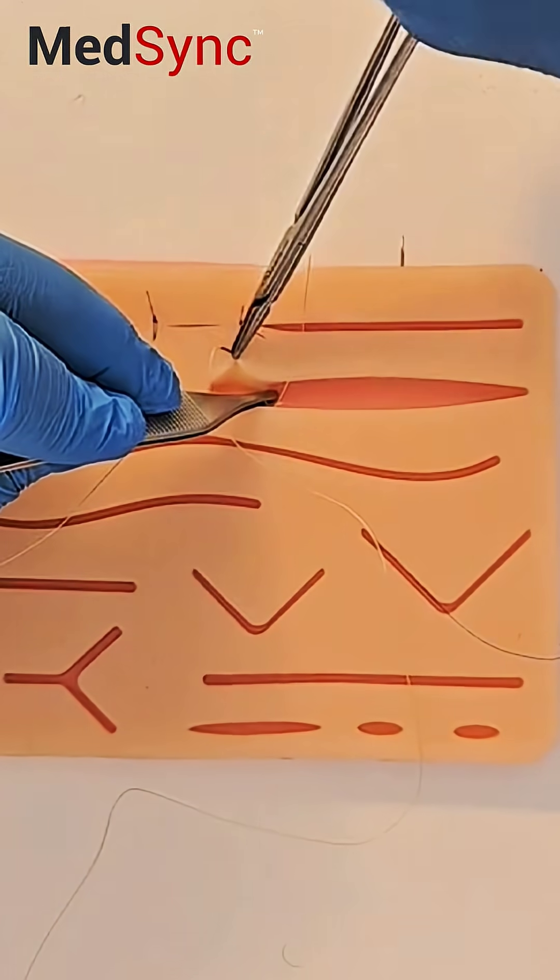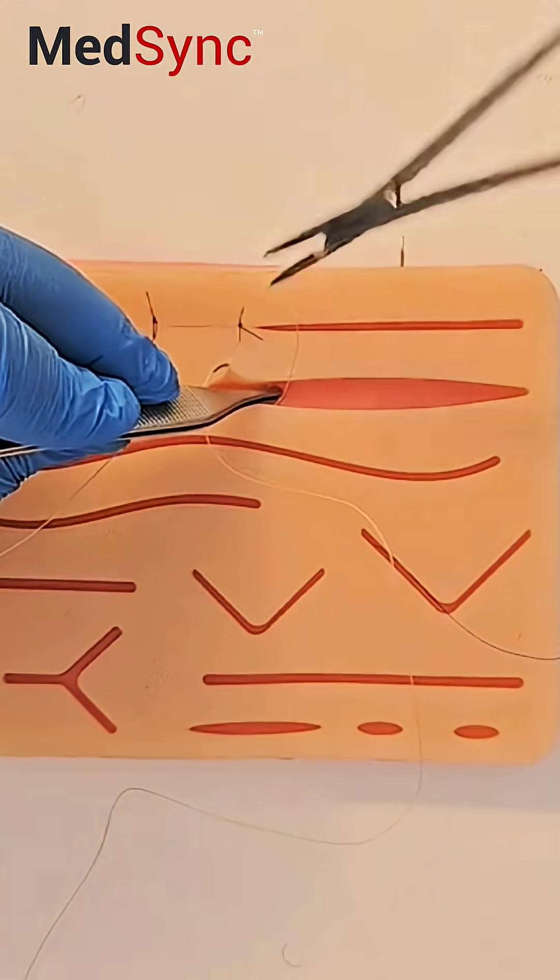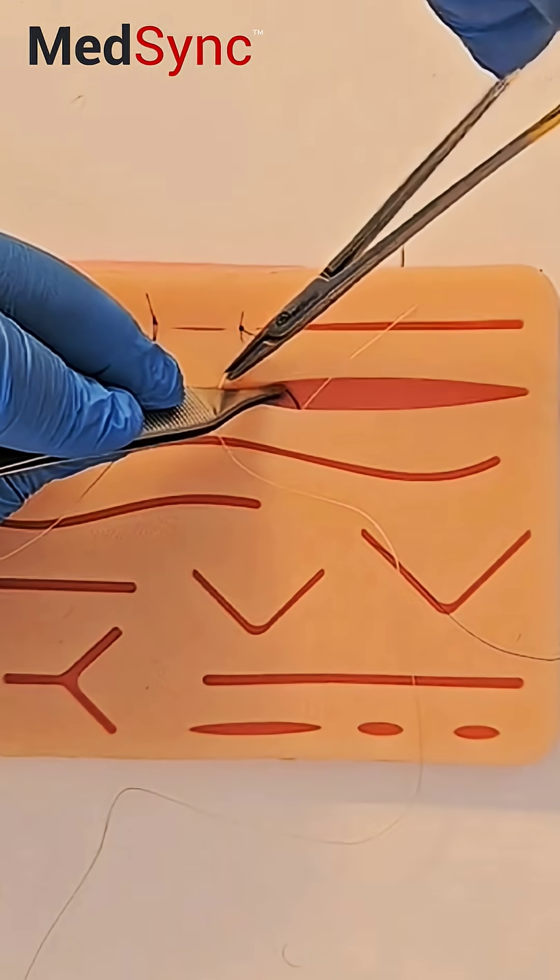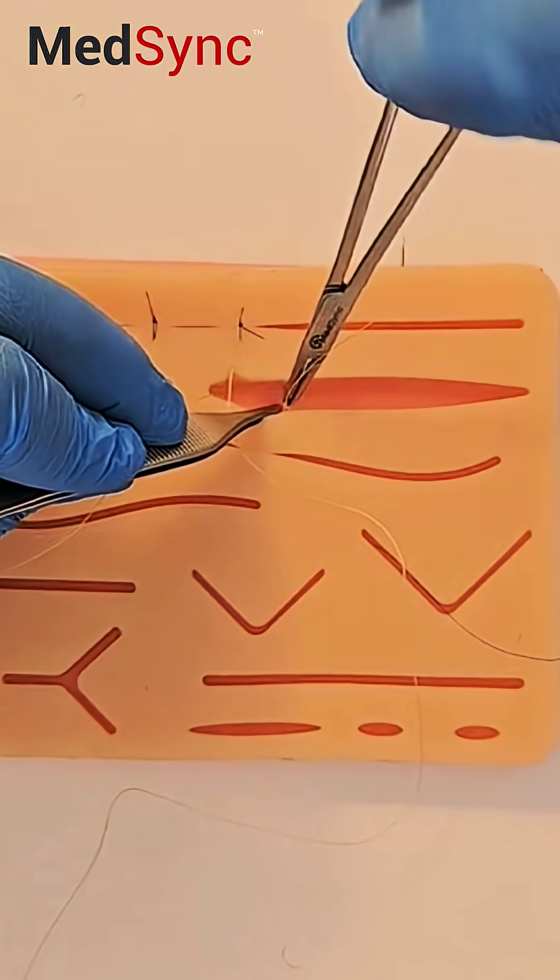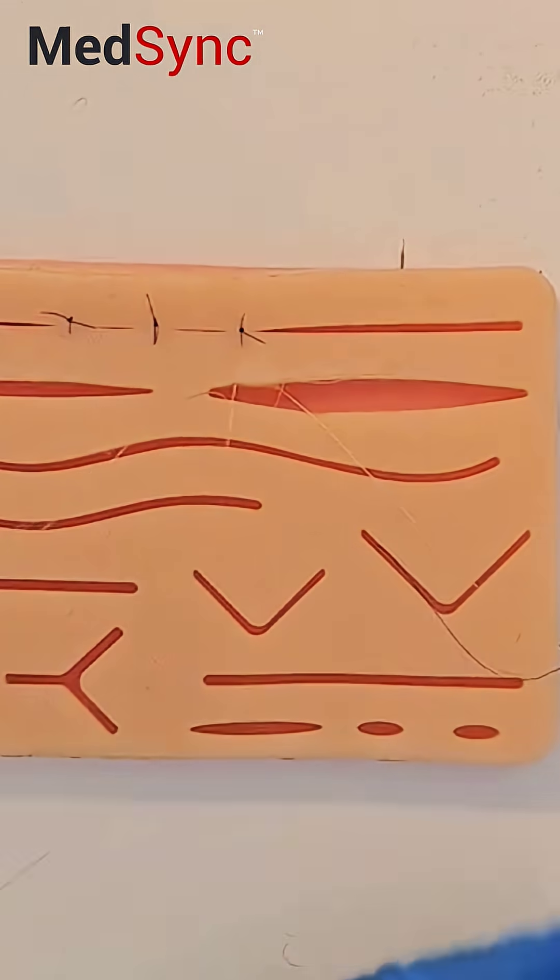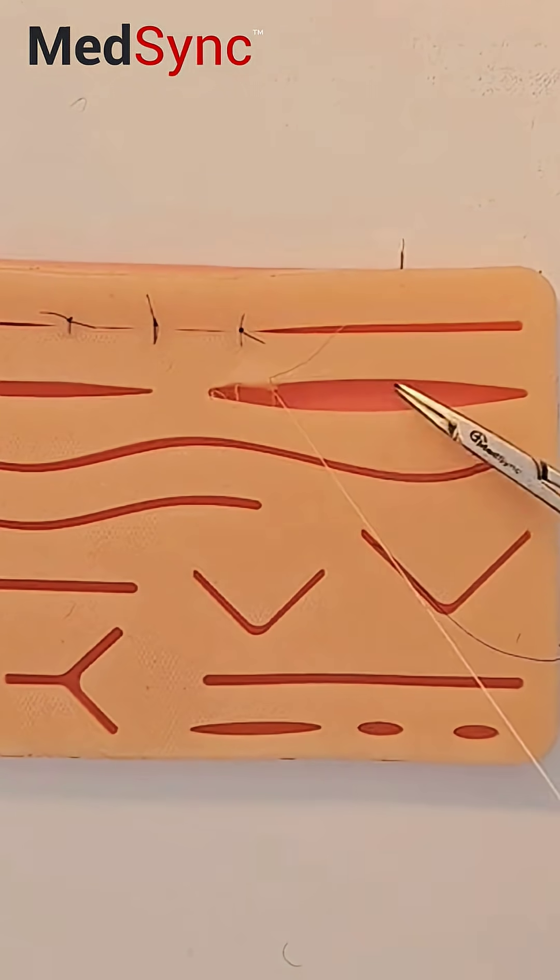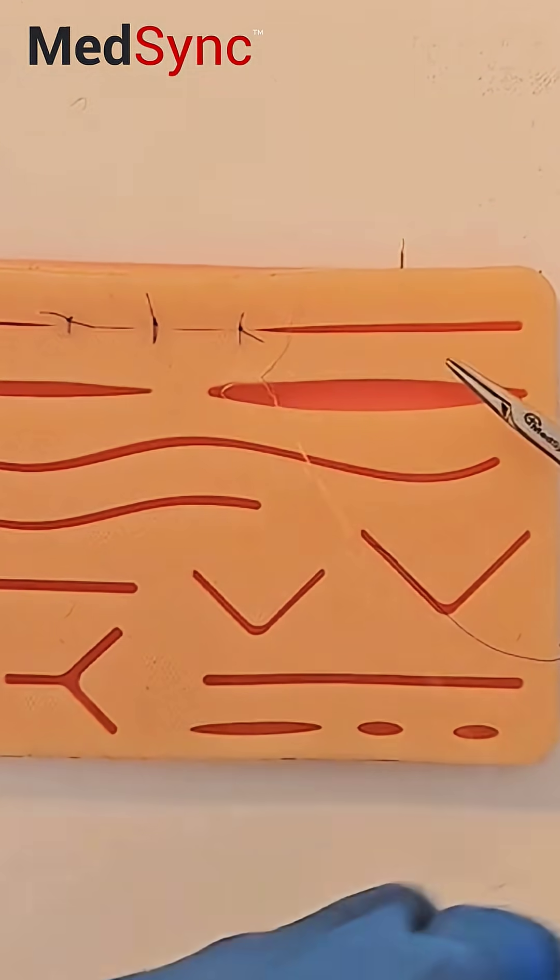So that's it there. I slide my fingers down, push it through a little bit more, follow the curve so I don't rip the skin, and pull the suture along the wound axis, so not up in the air, but along it.